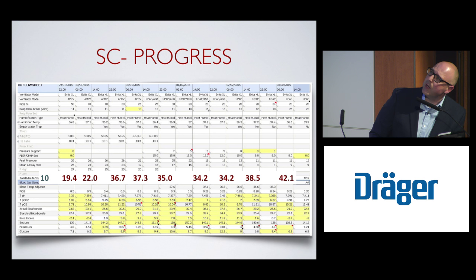After a few days, you can see here, this is 24, 48 hours, 3 days, 4 days, it goes down to 28% oxygen with better gases. CO2 is cleared, but we've got an issue with the mean airway pressure. Mean airway pressure is 25, 23 to start with, and then we start weaning.